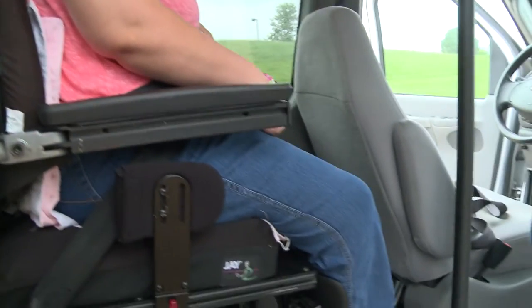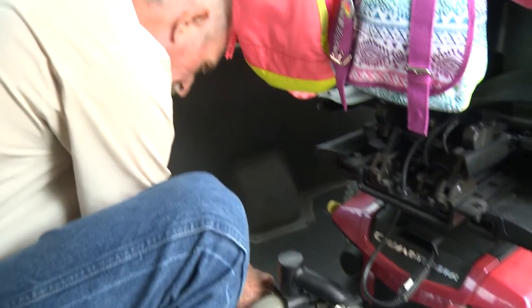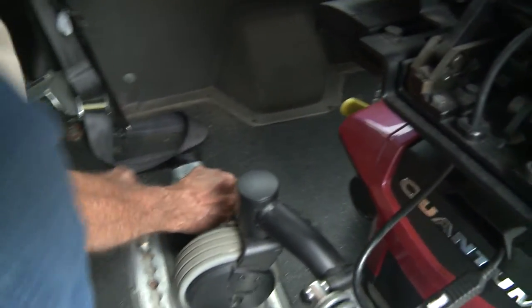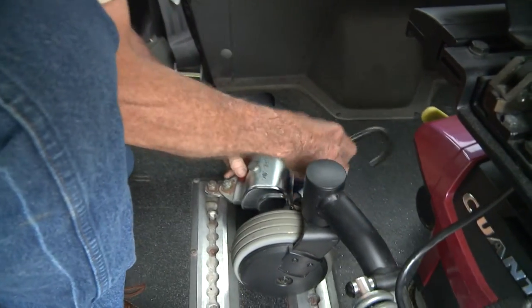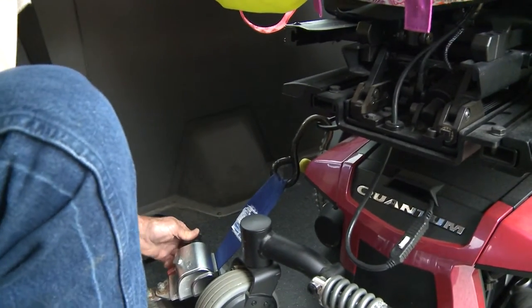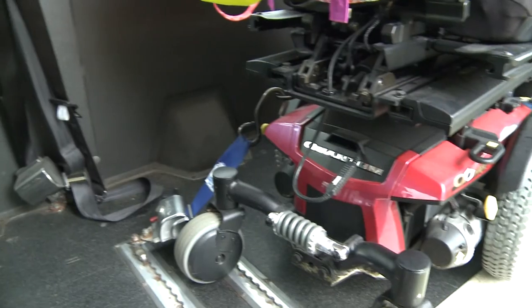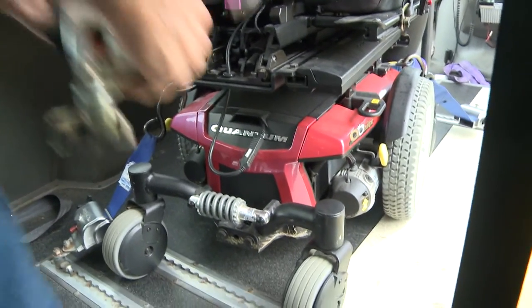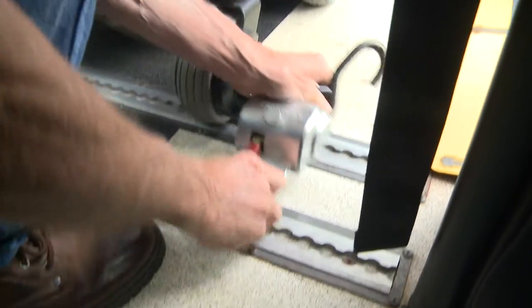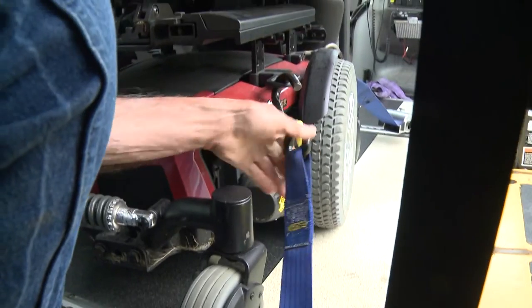Okay, now we'll go and do the rear — same arrangement. Secure these into the floor. Make sure they stay tight, and we will ratchet these down manually in the rear on that side. Doing our next side — this will be our fourth of our four securement points. Secure in the floor, make sure it stays snug, and utilize our hooks to draw it down snug.